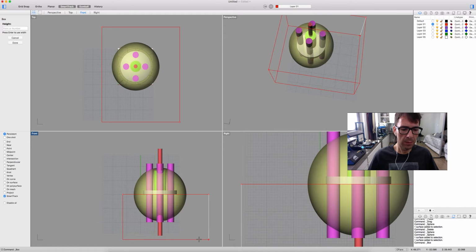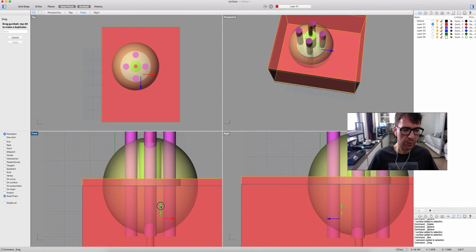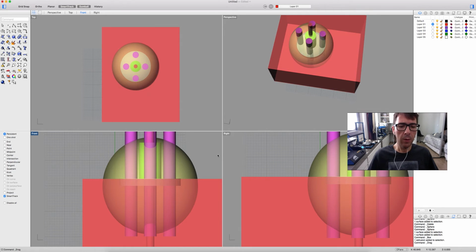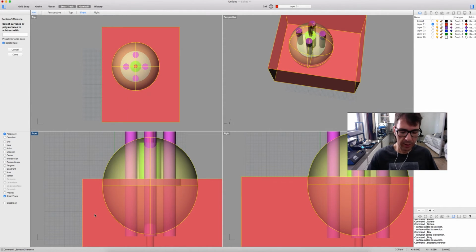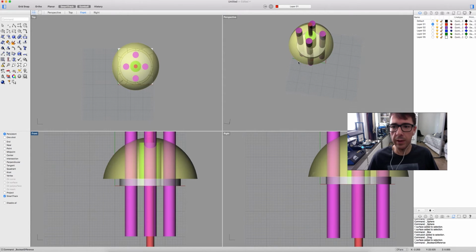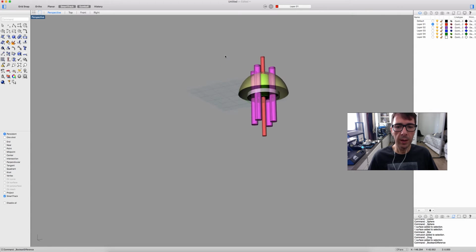Okay, it doesn't matter. So here we have a box, okay. Let's just move it. Oh, I think here is okay. Now we're going to delete the other part of this sphere. So we're going to select this sphere, solid, difference, and now we click the square. And now we have the glenosphere cut, and here we have our glenosphere.